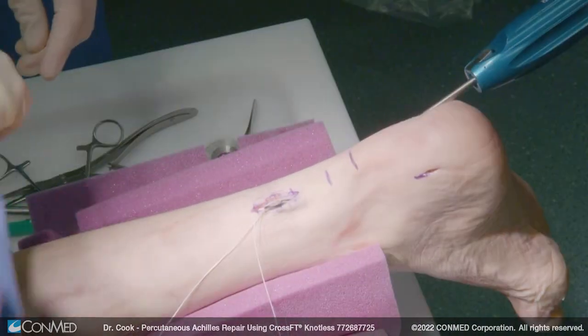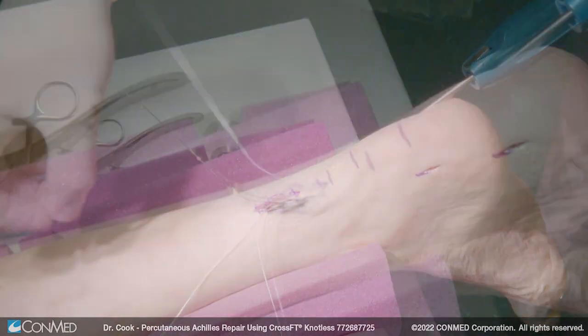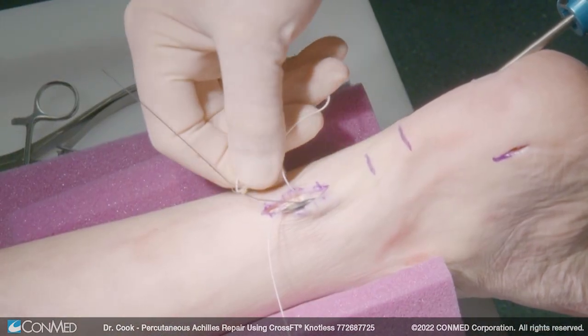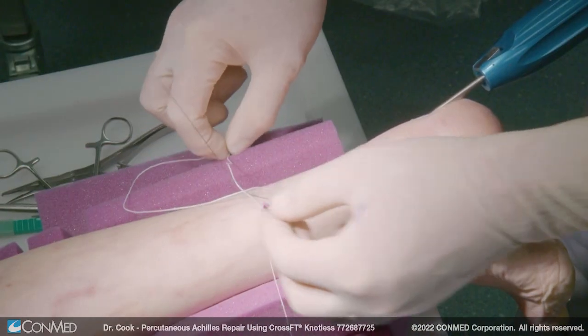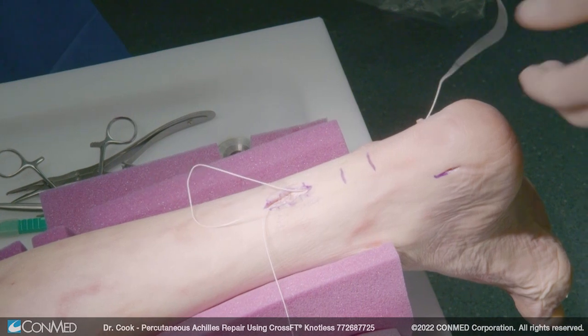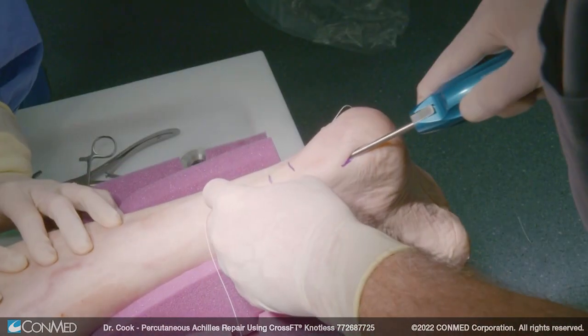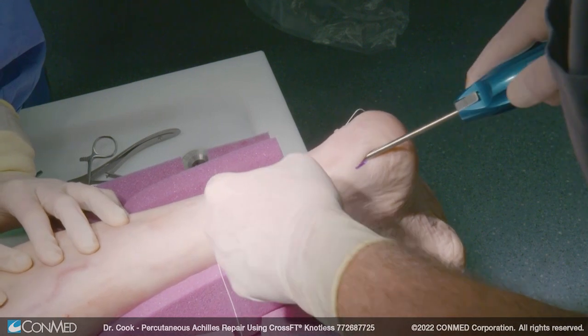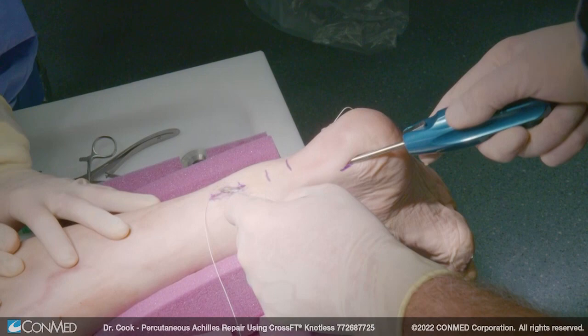Then we'll pass this up and take the medial suture. I often times use two of these sutures simultaneously. Then we'll just pull this down — we've now delivered this one, so we'll come back and do the other one. What's really nice about a technique like this is if you've got some kind of wound down below that's a problem, you can actually bypass it — you can go even higher up on the back of the limb.